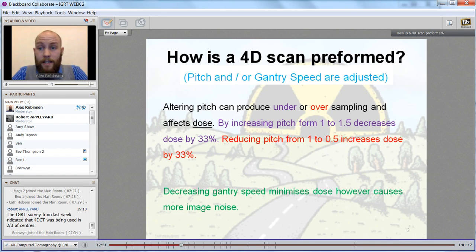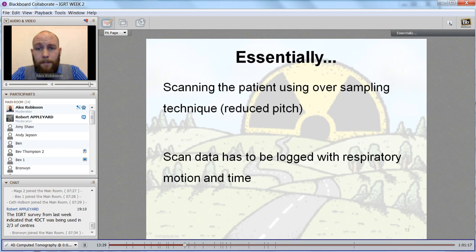Now, I know that on the Siemens scanner that I previously was working on, one of the safety features to ensure that we never overheated our anode, causing our tungsten and copper target to crack, and to ensure that we never overheated our filament, was that the scanner wouldn't be allowed to be on for longer than 90 seconds. That is considerably longer than a 10-second scan. However, 90 seconds still isn't a long scan if we really consider the time. The thing that takes the time is all the setting up of the 4D scans, and I'm going to touch onto that in a bit.